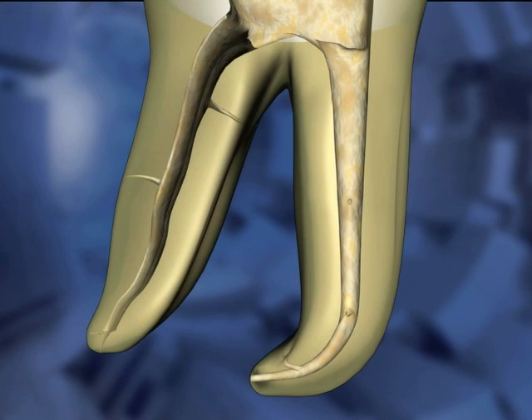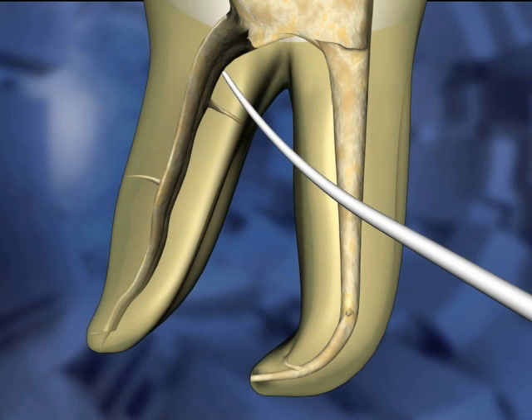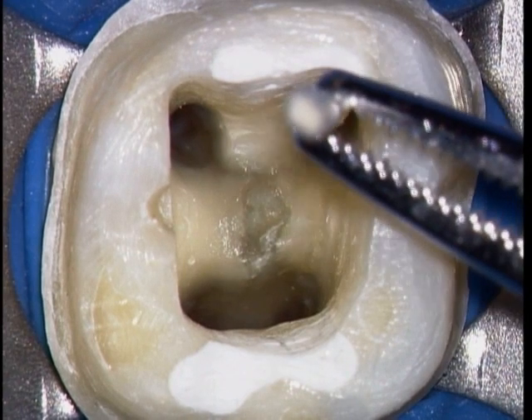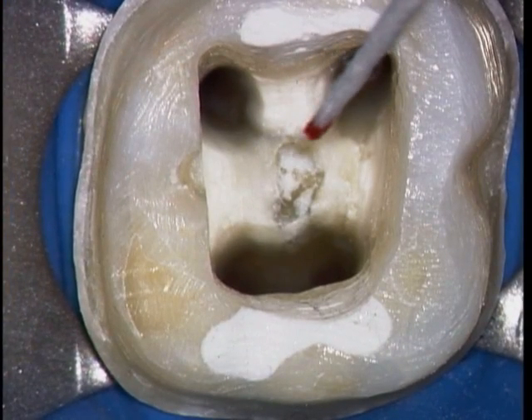With the tooth cleaned and shaped, it is time to fit a master cone. One way of determining a final working length is with a paper point. A paper point is inserted to the length — it should come back clean and dry. Insert the point a bit further than the previous point. When the paper point comes back showing red, you've gone past the apex.